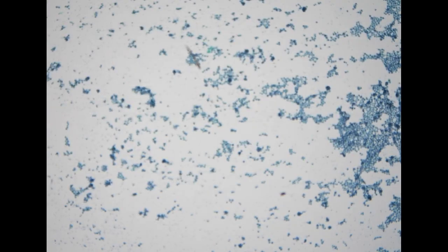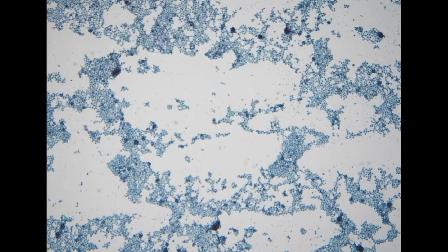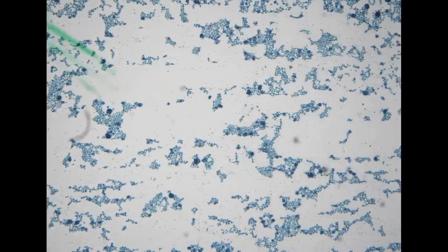So this is the second specimen. We've already confirmed the loss of tumor suppressor protein in the prior specimen. So this one is a mesothelioma.